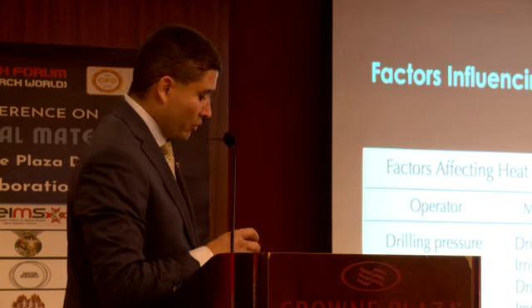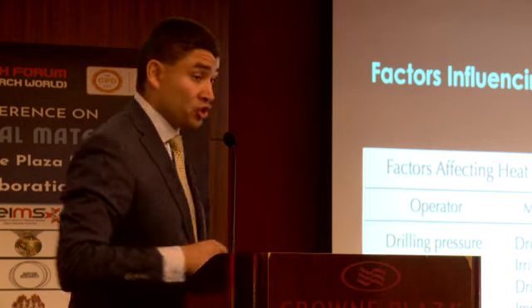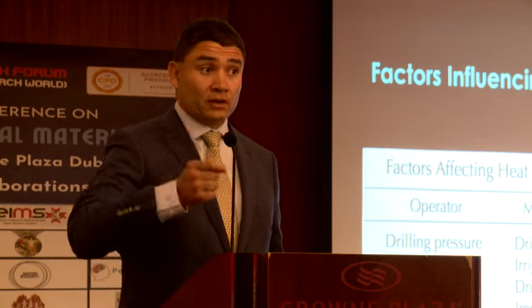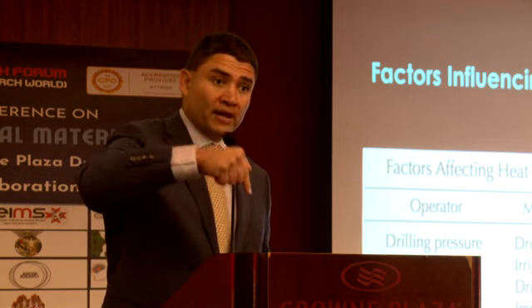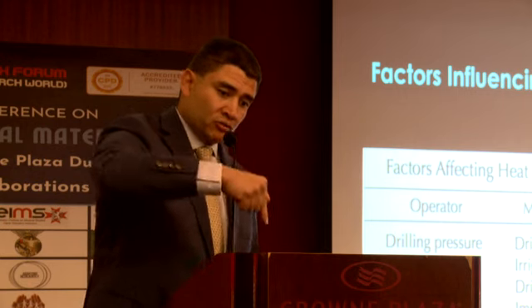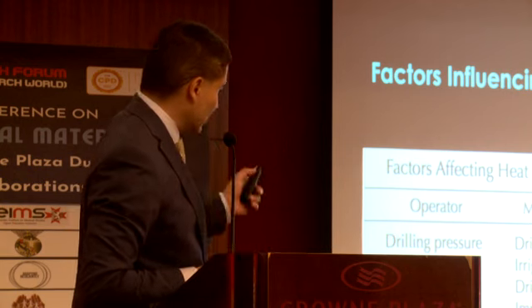And that is, from the operator's perspective, we have the drill pressure, the status of the drill, the motions of the drill. How many times have we been told, okay, do peck drilling? Peck drilling means pumping action. So you put pressure, you release pressure. Put pressure, release pressure, until you complete the osteotomy, right? That's peck drilling. That's motions.